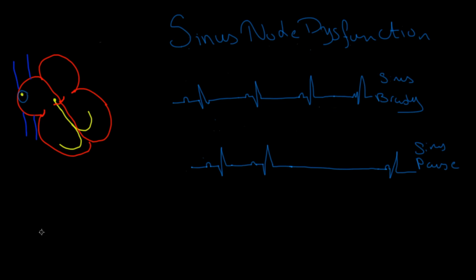We know from previously that we can use a single chamber atrial pacemaker, and the reason for that is easy. If the SA node doesn't work, the lead is going to sense it and send it to the generator, saying, hey, the SA node is not working anymore. Then it's going to start sending out a pulse, and then an atrial wave, and then the heart contracts, and then again another pulse, and then the heart keeps beating.